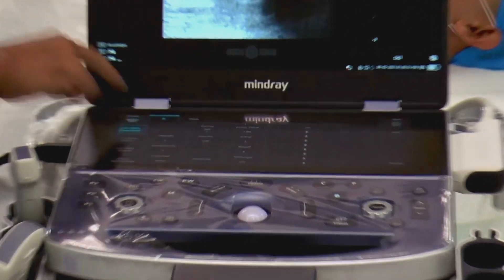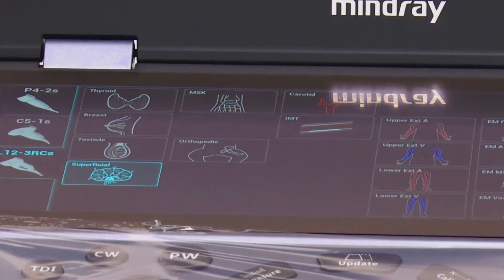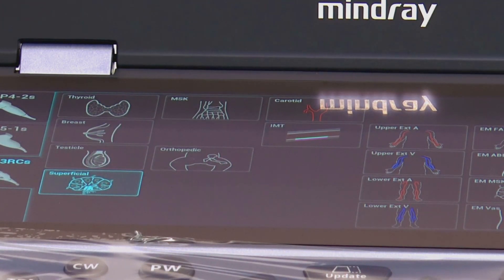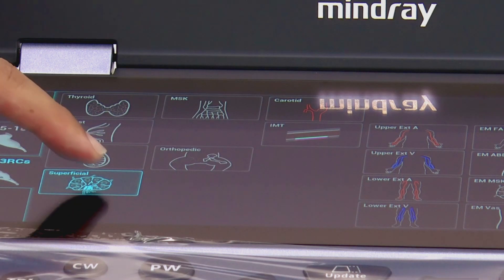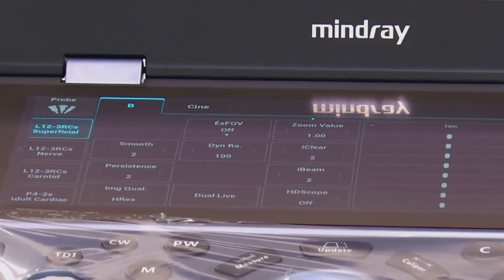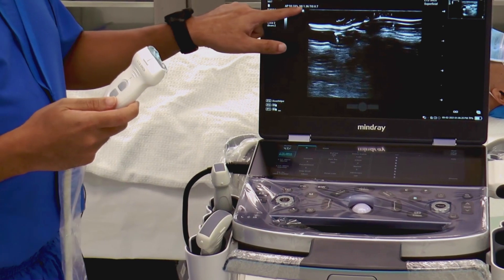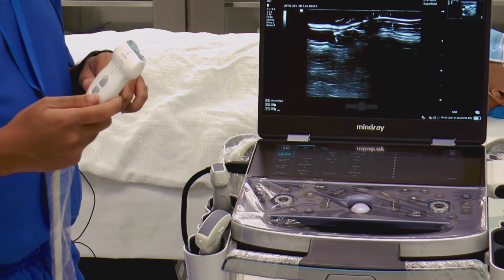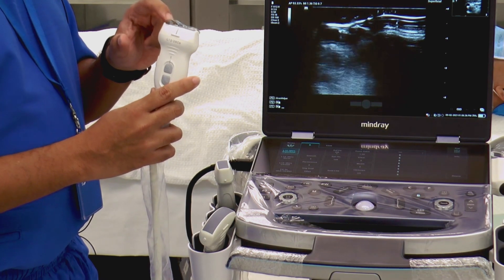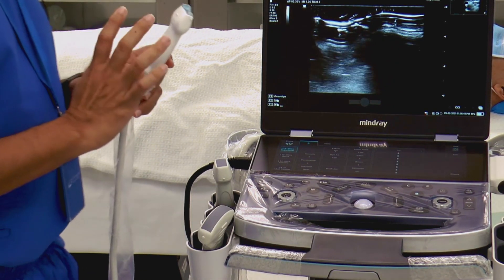When we choose the probe, in this system there are presets — basically settings of the machine for a particular examination. I've tested two: thyroid and superficial. We thought superficial would be the more appropriate one for this ultrasound demonstration. There's no airway preset. To start off, we've put some gel. It's important to note orientation. By convention, we put the marker on the patient's right in the transverse scan, and when we do a longitudinal scan, we put it on the cephalad side.